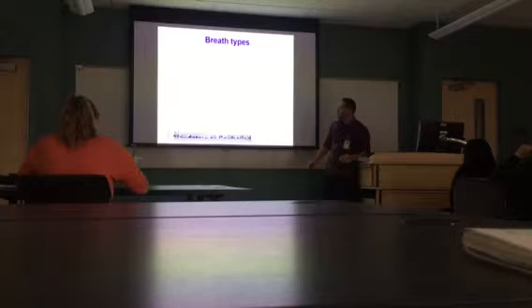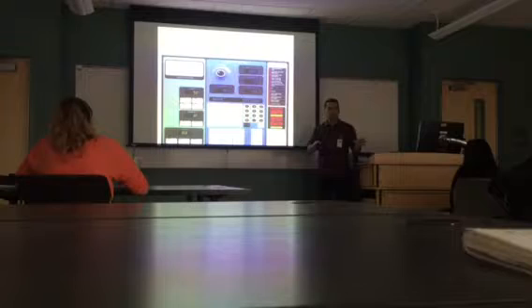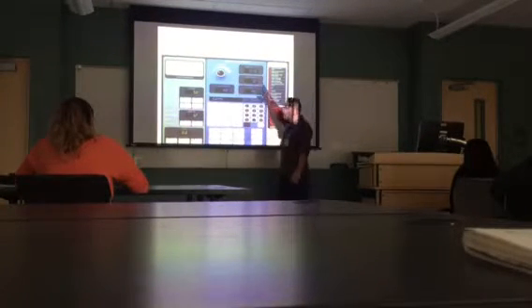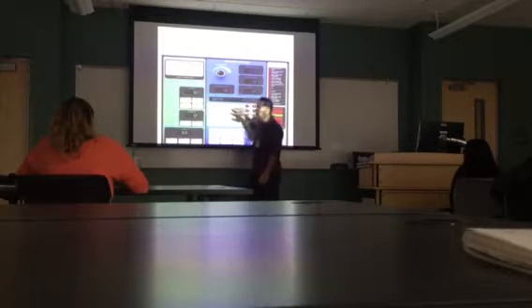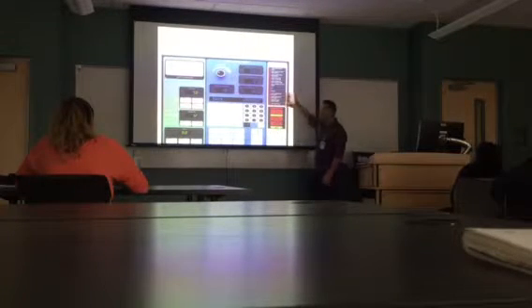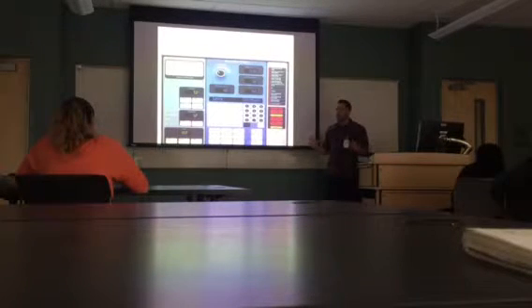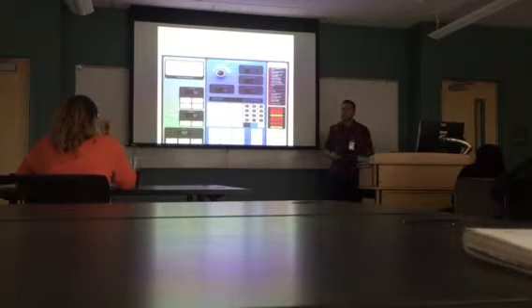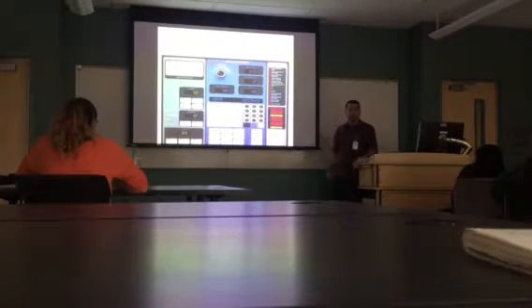All right, this is just a different ventilator screen, so it doesn't matter which ventilator you see at your hospital, it's the exact same thing, like I told you. You set parameters in one location, you find out what the patient is doing in another, and you also have a list of alarms that let you know what the problem is. By and large, studies have shown that ventilators will not fail; it's always user error. I think the percentage is less than 2% of issues being related to a mechanical issue with the ventilator.